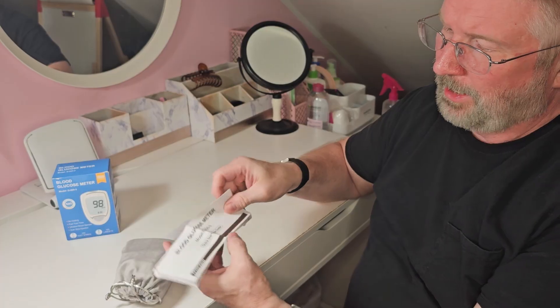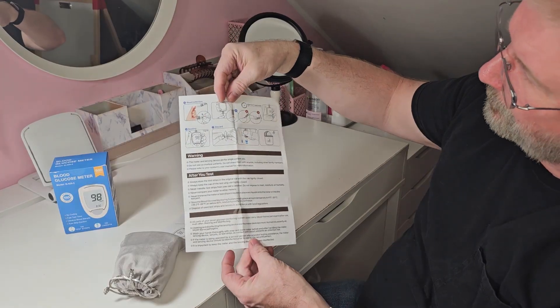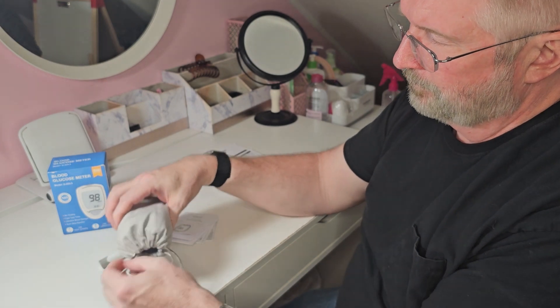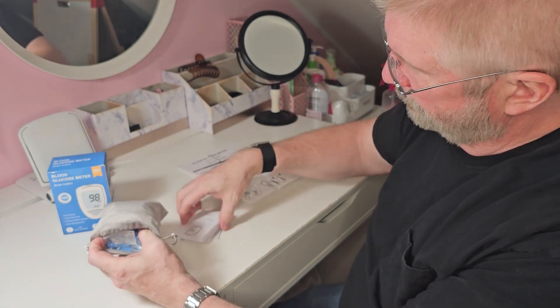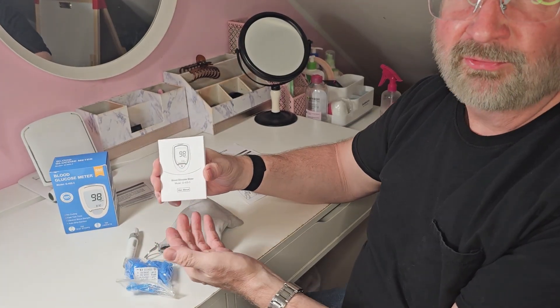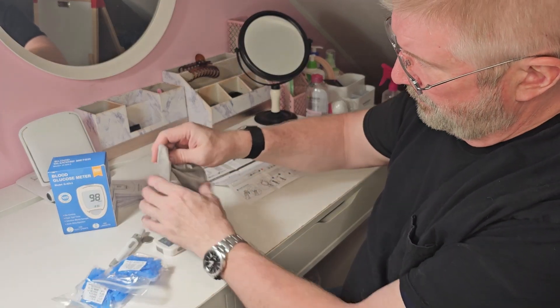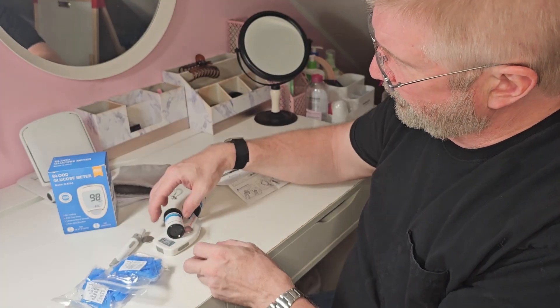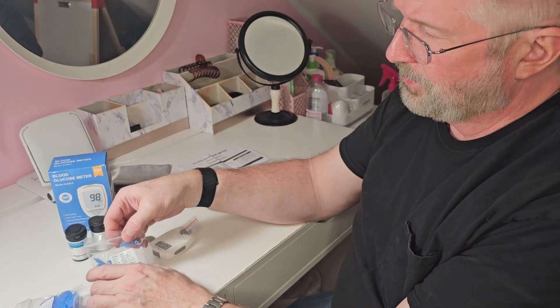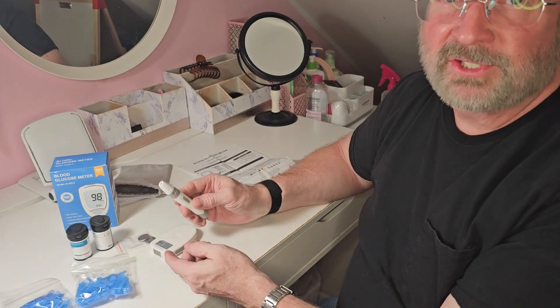So this is your user guide — it'll give you an overview of everything, front and back. There is a more in-depth user manual; definitely read through that, there's a lot of information. It comes with a nice storage bag, these are your test strips, and these are your lancets.